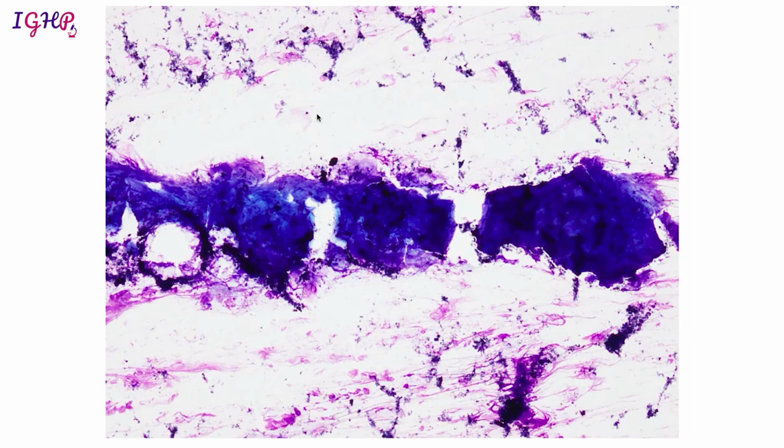Now suppose from this FNA we get a sample like this. Now in this sample we do not have any epithelial cells. There is some debris, some dirty material over here which is actually non-diagnostic. So with this we could not explain the mass in the head of the pancreas, and we are going to say that this is inadequate. So this is category 1, and for this we are going to ask for more passes.